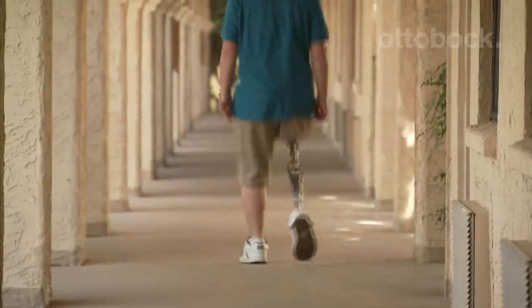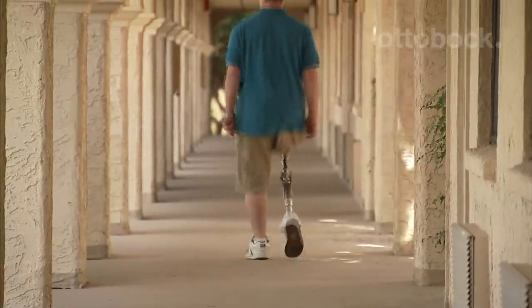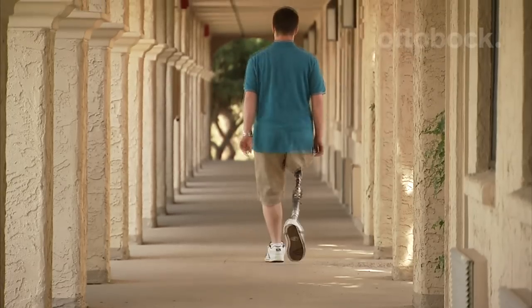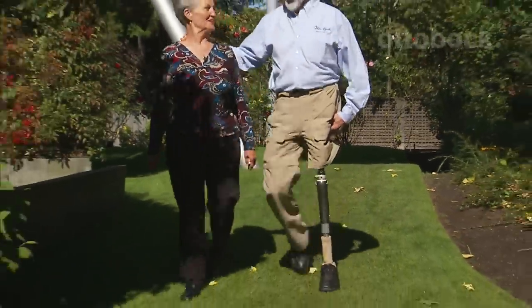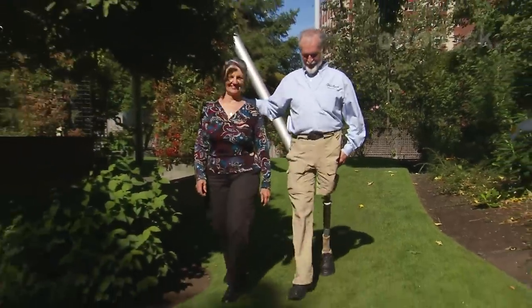People who use the Helix report that they can walk faster and need less support from canes, crutches, and walkers. In addition, the Helix helps users regain independence and require less support from caregivers for daily living.